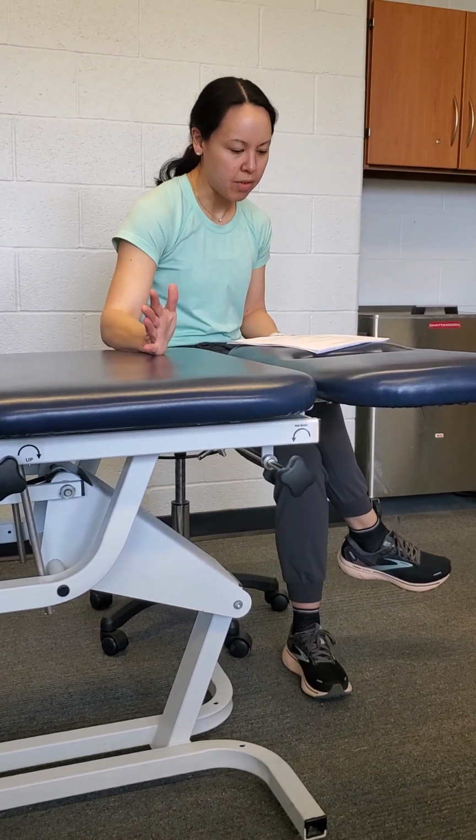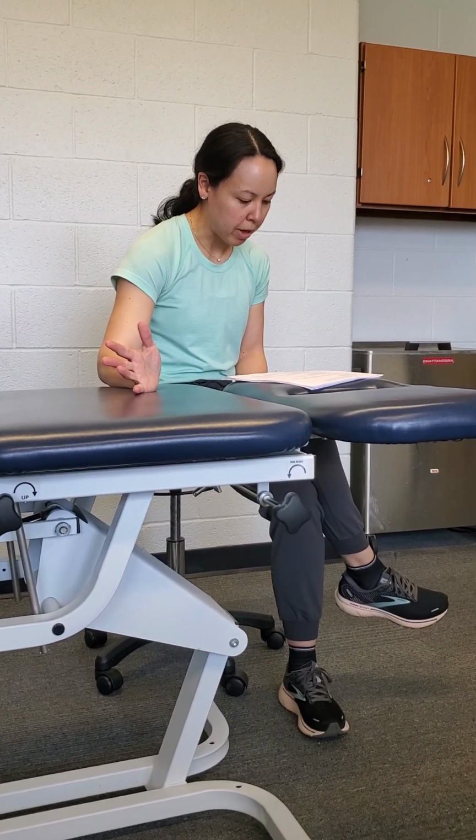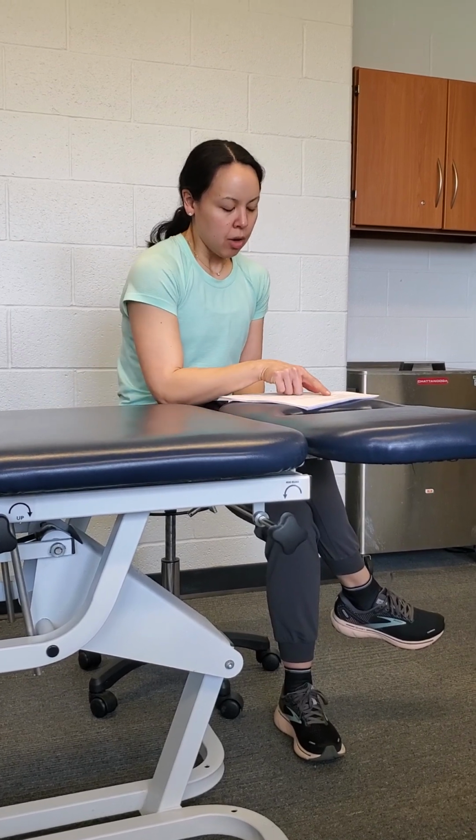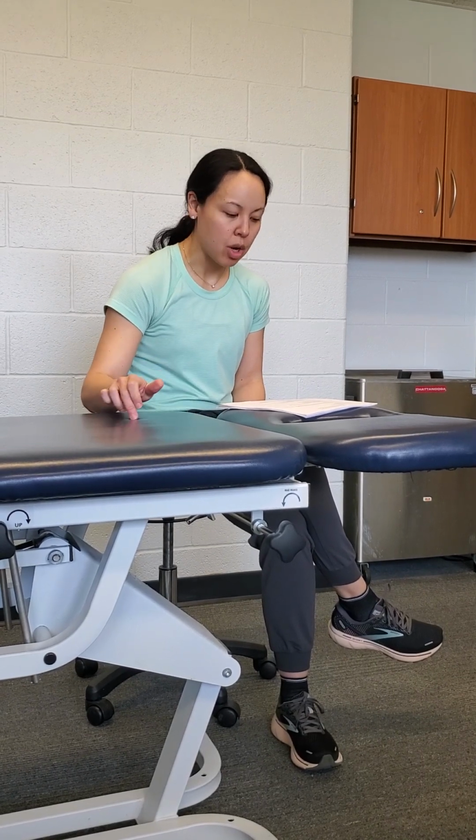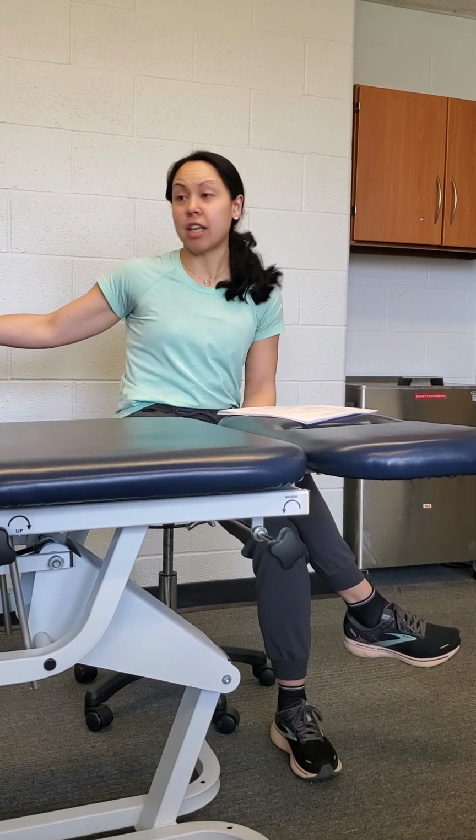Okay, so I think you guys have an idea of what BFR is, but essentially for documentation purposes, this is the first thing he talked about: you certainly want to make sure that you're documenting in your note the patient's personalized pressure, which is calculated by the machine, and the total tourniquet time.